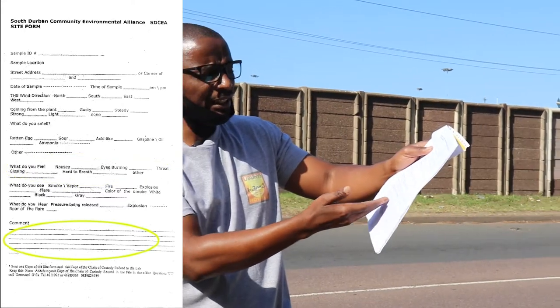And then you identify probably what kind of smell — was it a rotten egg smell, was it a benzene smell, or whatever the case may be. Then you note that. And then what did you feel? For example, I was feeling nausea, I was feeling pain in the throat, headache — those are symptoms of being exposed to such toxic chemicals as well. And then you would write any other related comments.